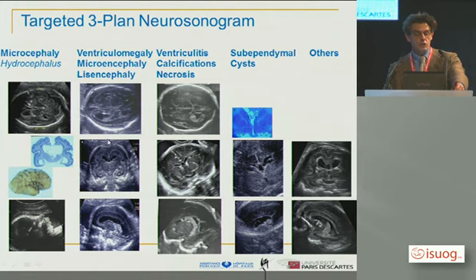And if you turn in a coronal view the same fetus, you would see that there is a very large space around the brain, that the main fissure, the Sylvian fissure, is very, very smooth and poorly developed in the early third trimester. And if you move to a sagittal scan, you will see that this is even flatter than you thought and very smooth indeed, with lissencephaly.